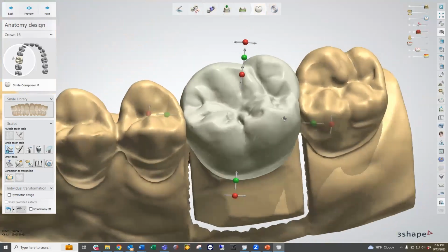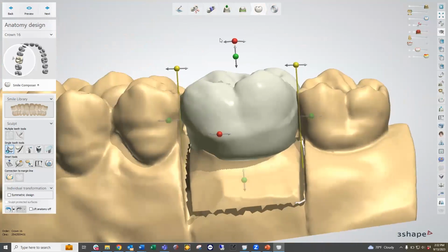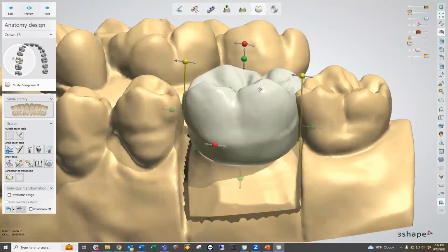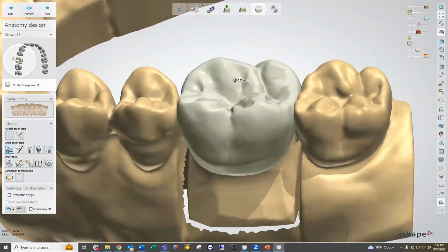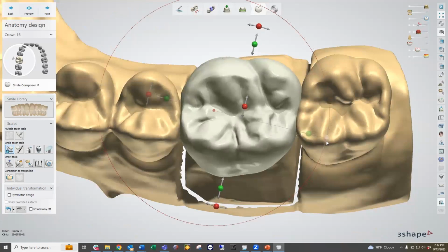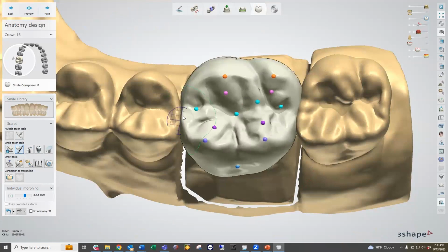So after I've placed my crown where I think it looks best, I might actually rotate this down a little bit here. Move this over. All right, once we've got it into place where we like it, we can then move on to the next tool, which is going to be the individual morphing tool, the option that allows us to do intermediate changes.